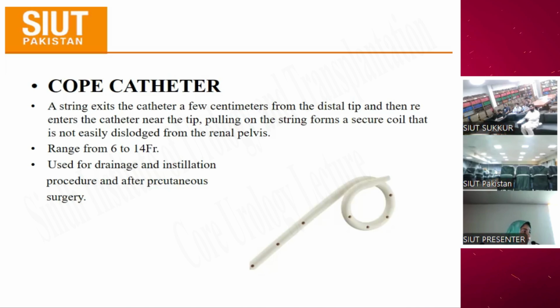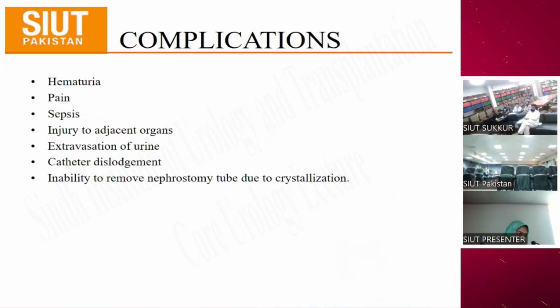If you have a practice somewhere in Western Europe, there the biodegradable stents are available. And if you need a stent for a very short period of time, which may be less than 6 weeks, then these biodegradable stents are available to you, but they are very costly and they haven't come to this part of the world.